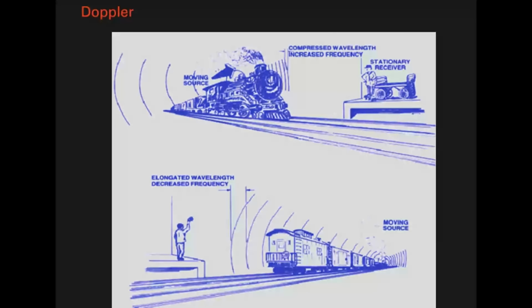And the reason for this is obviously that if the object is moving towards you and is sending out a sound pulse, because of this motion, the sound pulse is being compressed. And of course, if it's compressed, the frequency will be higher and we hear it as a higher frequency. And if the object is moving away, it seems like it's being stretched while being emitted. And so that means that it's lower.